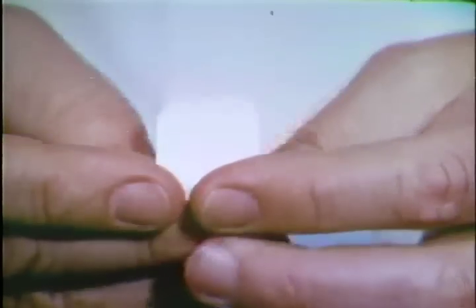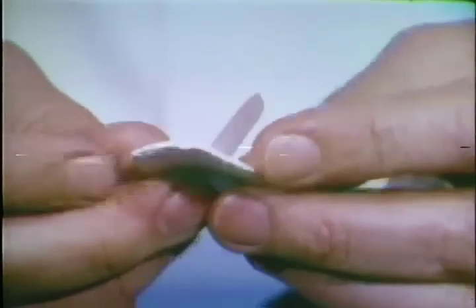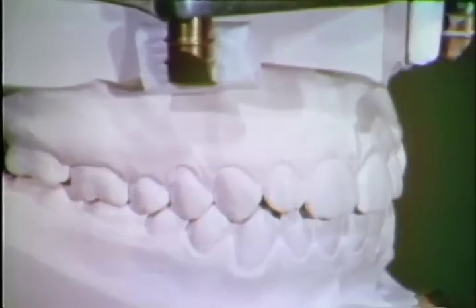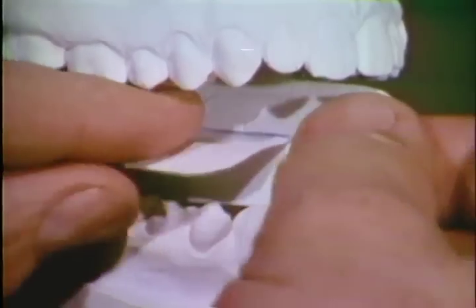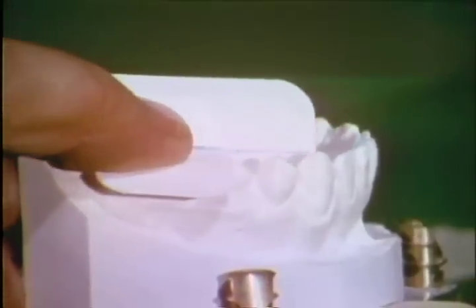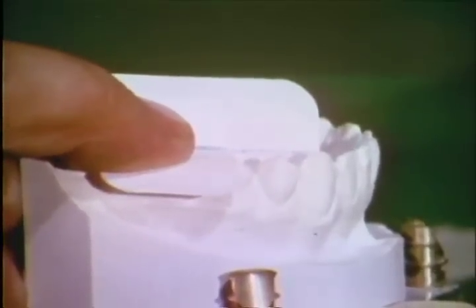With the tab side up, the packet may also be rolled lengthwise over a finger to further facilitate patient comfort. Proper insertion and positioning of the film is all important, so we use models to demonstrate. As the patient opens, the film is introduced horizontally and rotated into position. The packet is positioned with its anterior edge aligned with the center of the cuspid. To do this, it is necessary to position the anterior edge of the packet lingual to the mandibular central incisor. Note that there is considerable space between the bicuspids and the correctly placed film packet.